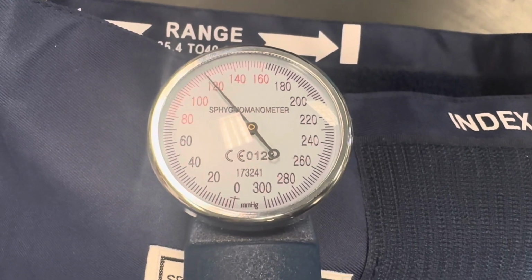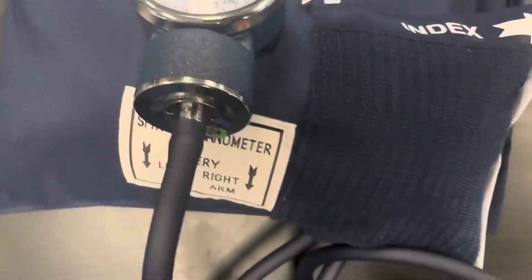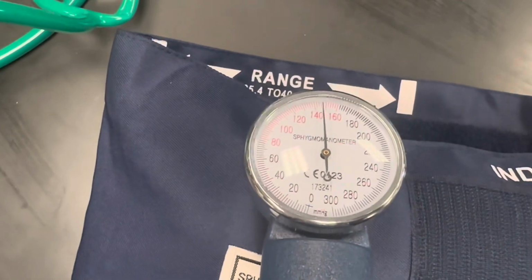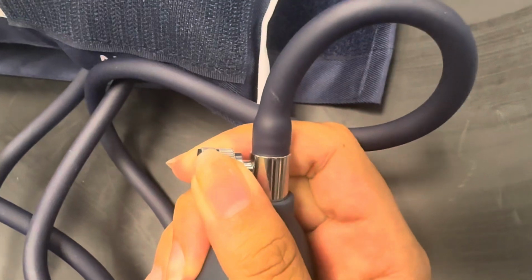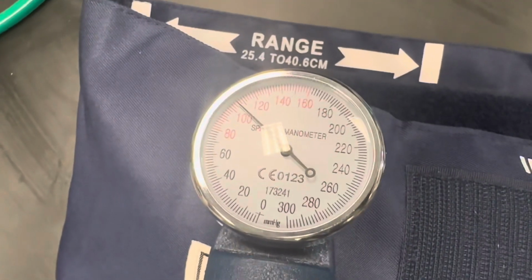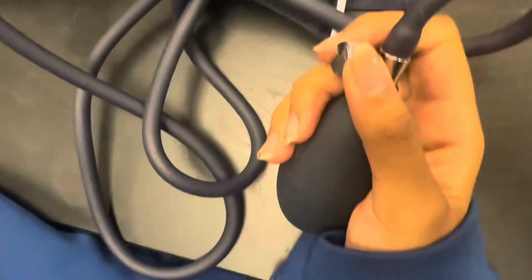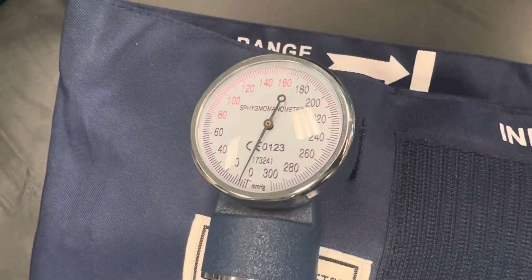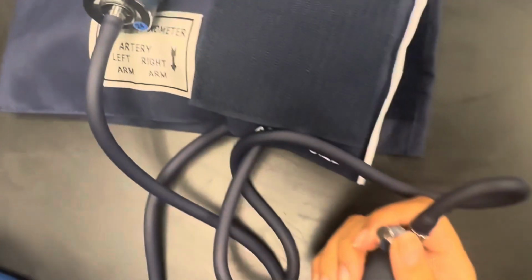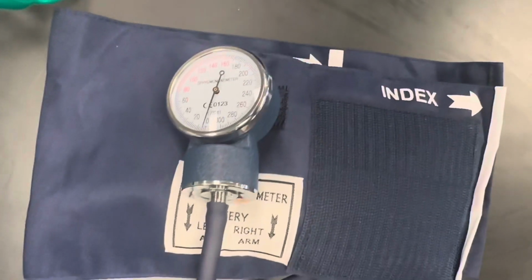And then don't deflate it yet. Get it to 160. Next thing. Okay. And then now we're going to slowly open the knob up. So go ahead and start slowly opening it up. And as you open it, you'll see that the blood pressure reading starts to decrease. And she'll continue to open the knob up. And as she continues to open the knob up, the dial will continue to go down to 0. And that is how you learn the initial stages of inflating and deflating a blood pressure cuff.